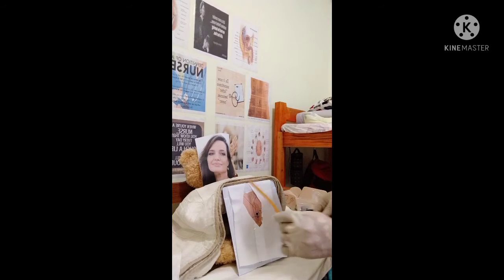So pick up the catheter at least 3 inches from the tip. Then we need to place the thumb and one finger of the left or right hand between the labia minora, separate and pull up gently. This is actually to straighten the urethra and facilitate the insertion.